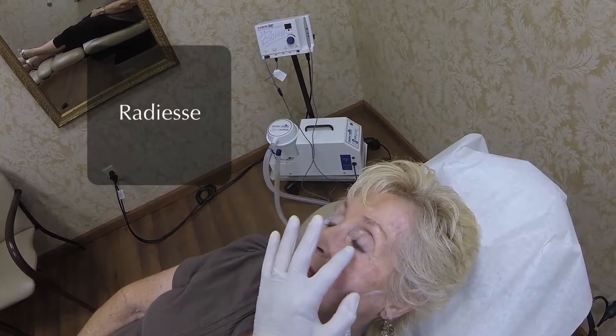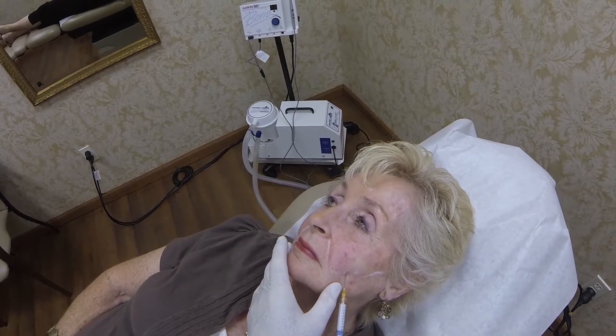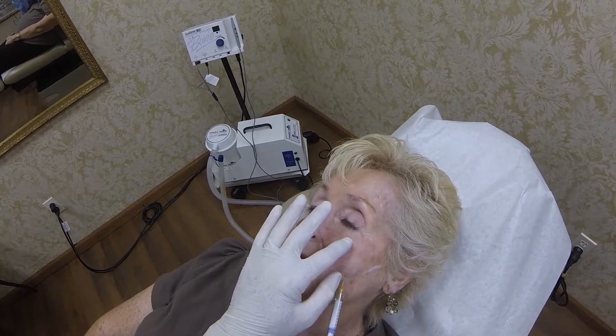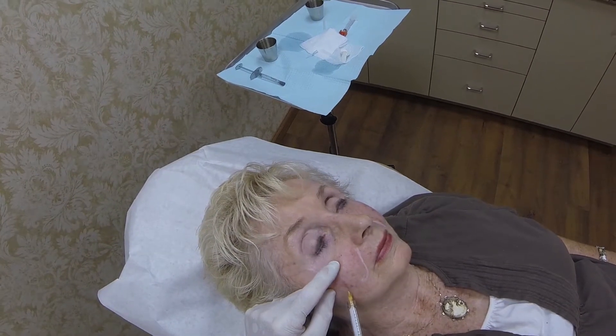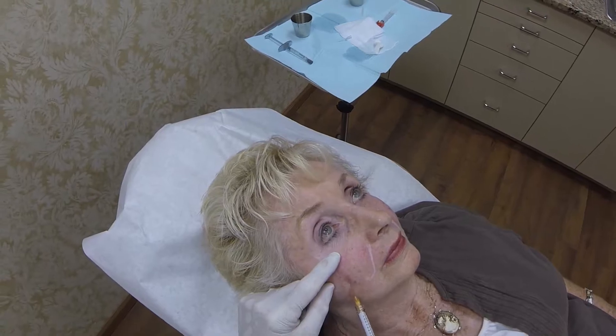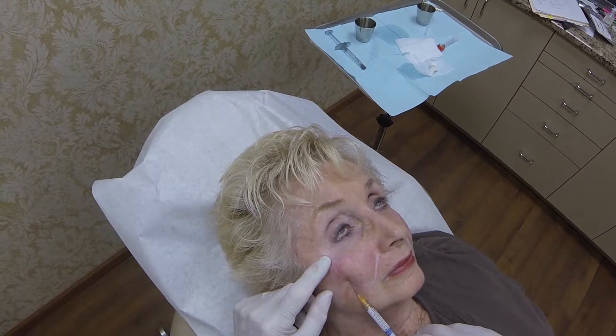I want to reflate that side to add more volume to make up for the skin loss on the right side. I've already marked on her with a white pencil where I want it, and I've already numbed her where I'm going to be starting the injection. Lift up the chin this way, bring the cannula way up here — you can almost see it right up there — and we're going to start to deposit the Radiesse. It goes a little bit deeper, and I can feel where I am, going over that malar bone and starting to add some volume there. With this technique, there's no lumps, no nodules — it's just laid down in strips, really covering that surface of that bone beautifully.